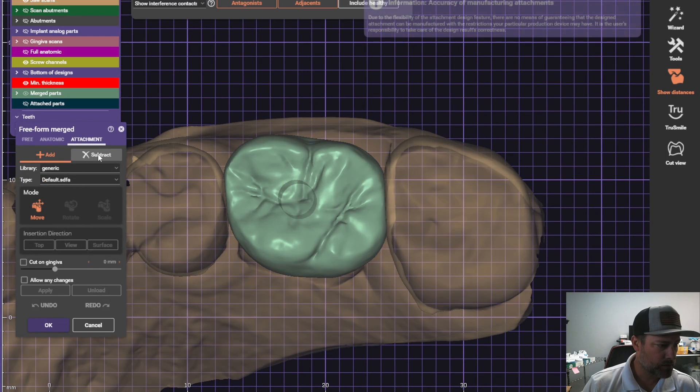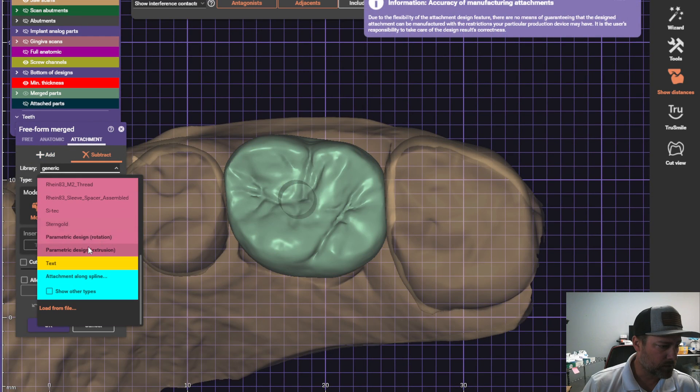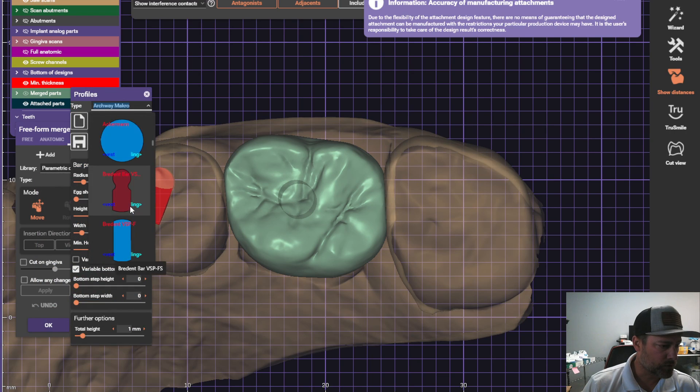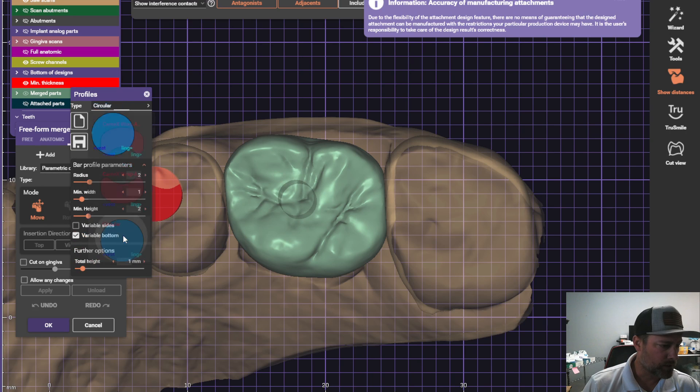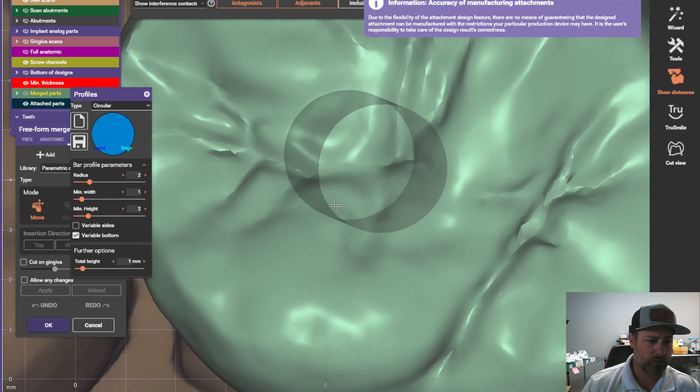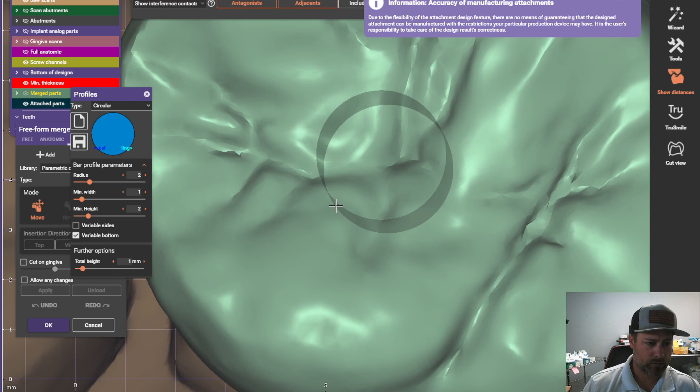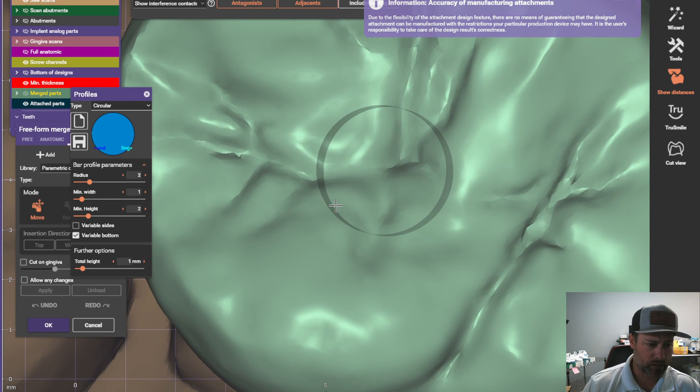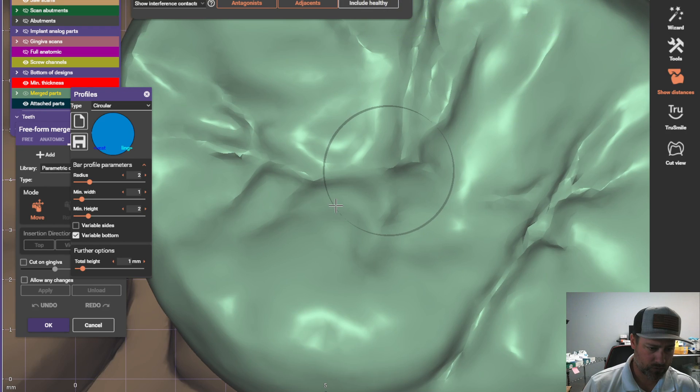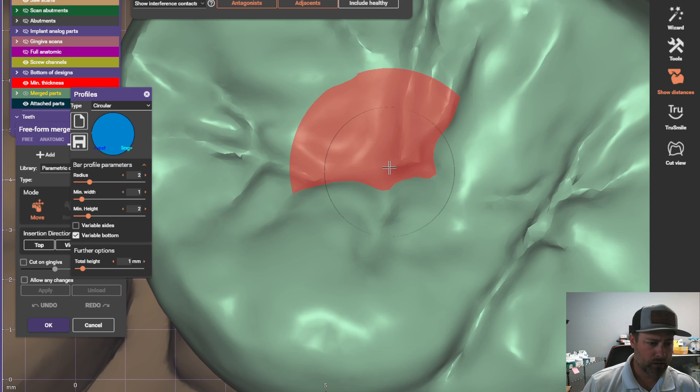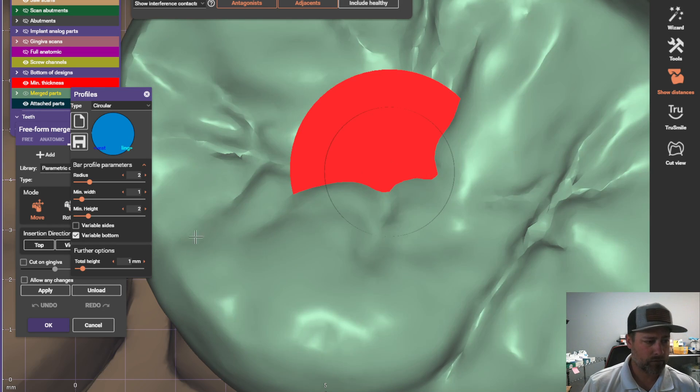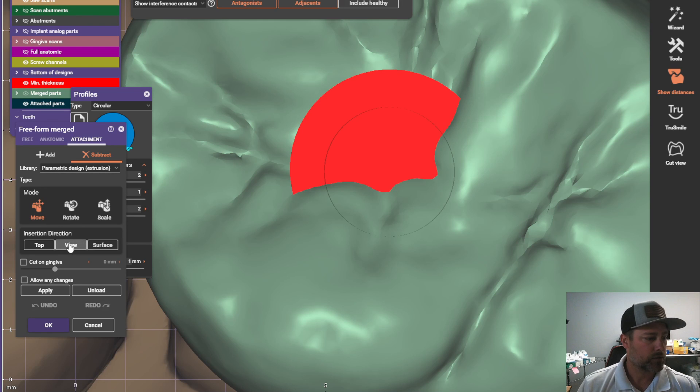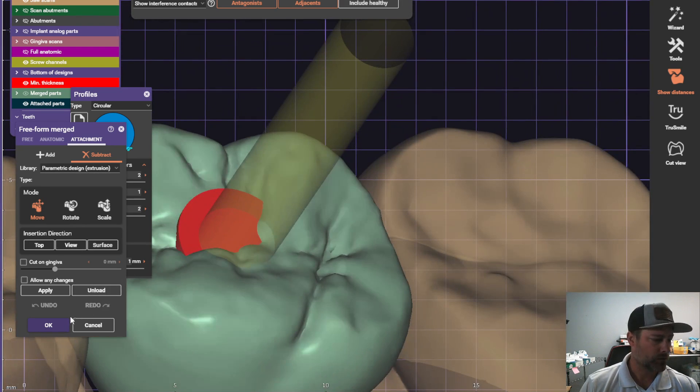Attachment, subtract, come down here to extrusion. We're going to find the circle right here. Now I'm going to line up my view on this computer screen so that I can not even see this circle. About right there. I'll click here. I'll click view. So if you click view, I'll show you what it looks like. So it'll angle this cylinder to the view that I have.